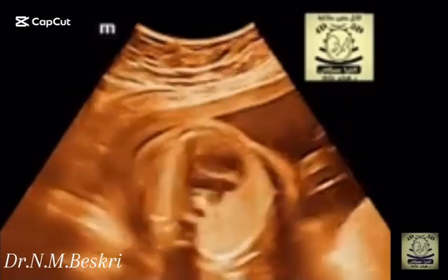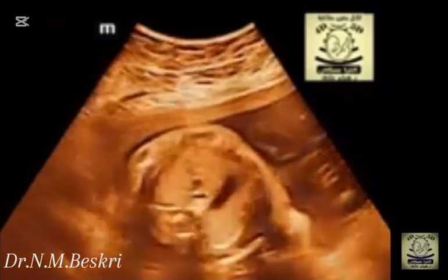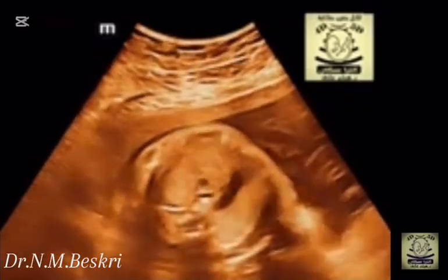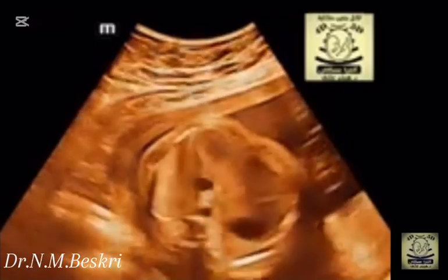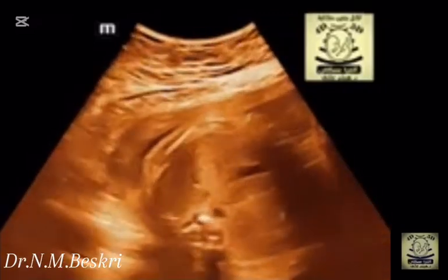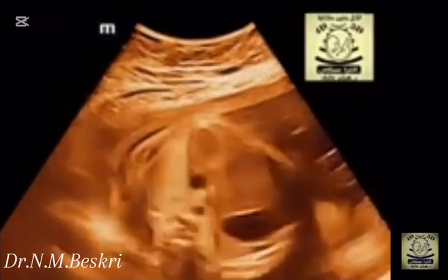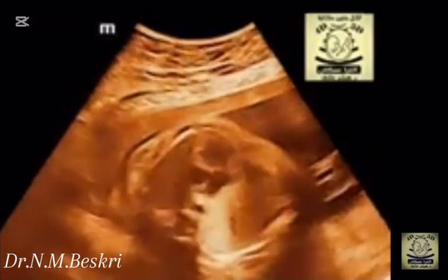It's quite confusing when you see the heart on one side and the stomach on the opposite side, but let's start analysing this case step by step to reach our final diagnosis. The intact diaphragm allows us to exclude any herniation.